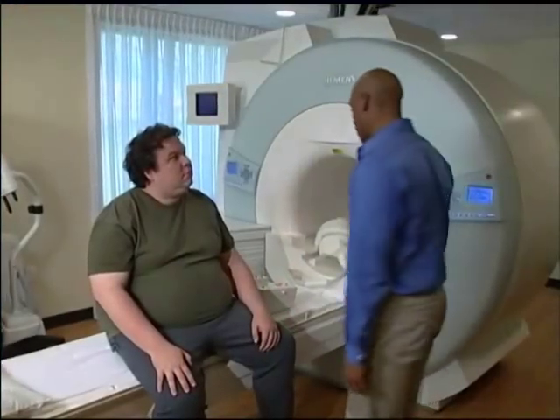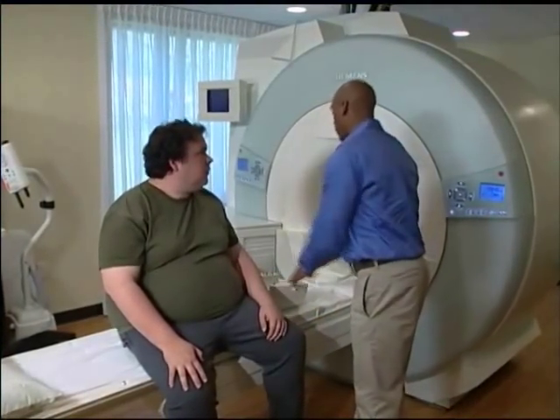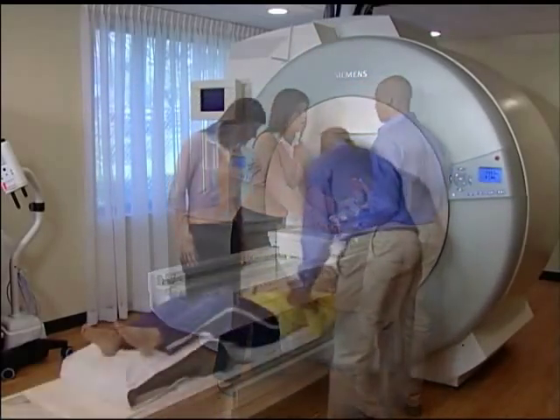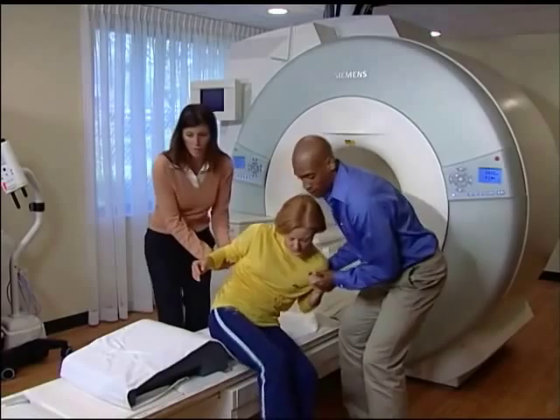This video also addresses proper patient preparation, examination, as well as how to correctly handle the surface coils. Finally, we will show examples of emergencies or accidents and how to avoid them, and how to respond appropriately should they occur. This video serves only as a supplement to a more comprehensive safety training program.